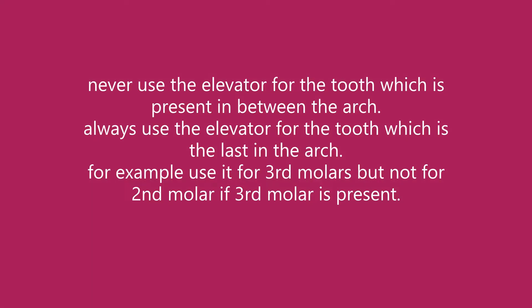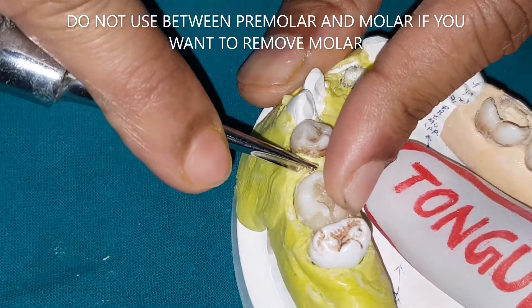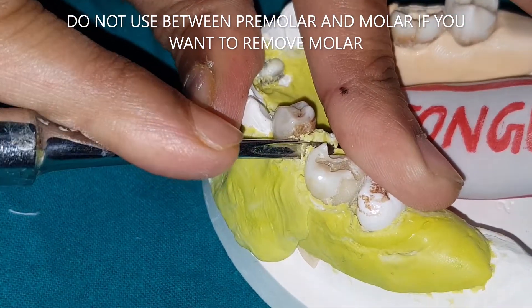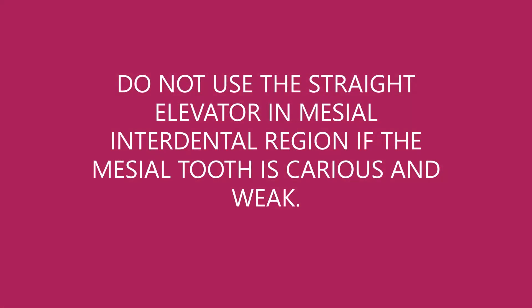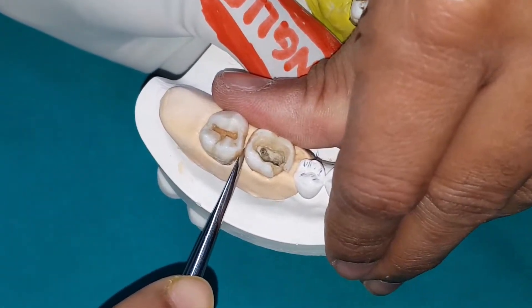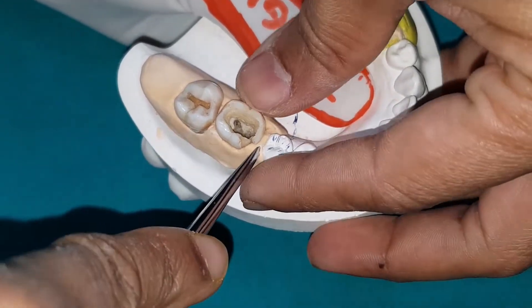Never use the elevator for a tooth that is present between other teeth in the arch. Always use the elevator for the tooth which is the last in the arch. For example, do not use it between the first premolar and molar if you want to remove the molar, because the premolar is weak and you may luxate or fracture it. Only if the first molar is the last tooth in the arch should you use it. Do not use the elevator in the mesial interdental region if the mesial tooth is carious and weak — the adjacent tooth may get fractured. Use parallel placement technique in such cases.